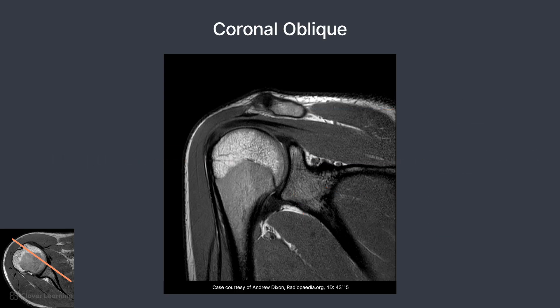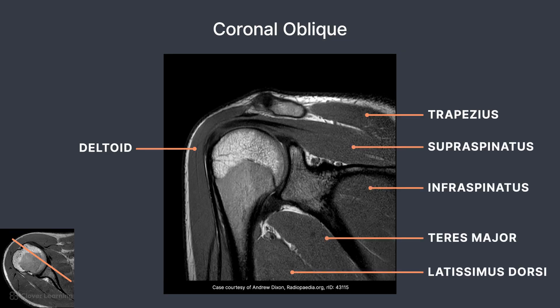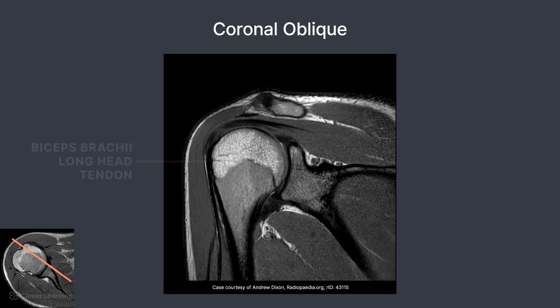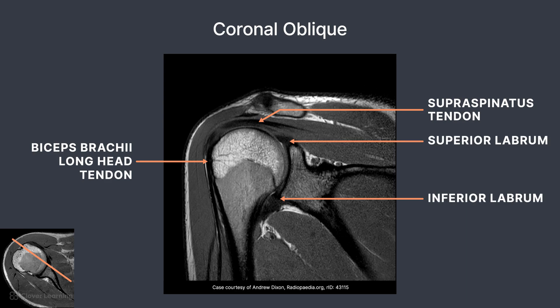Muscles demonstrated include the deltoid, trapezius, supraspinatus, infraspinatus, teres major, and latissimus dorsi. Visible tendons include the biceps brachii long head, which inserts into the bicipital groove, and the supraspinatus, seen crossing the superior aspect of the humeral head. The superior and inferior labrum are visible as dark, somewhat triangular-shaped structures at the edge of the joint. The labrum is a ring of fibrous cartilage that surrounds the glenoid and stabilizes the joint.